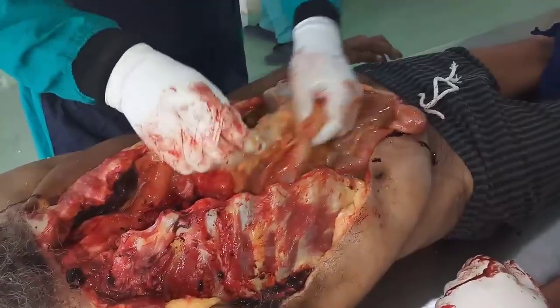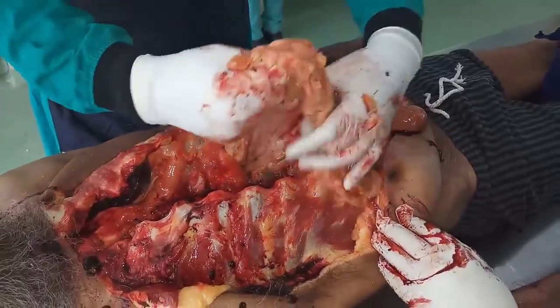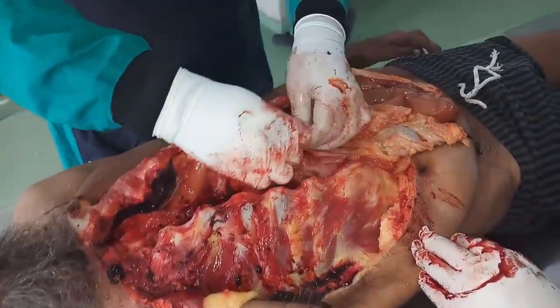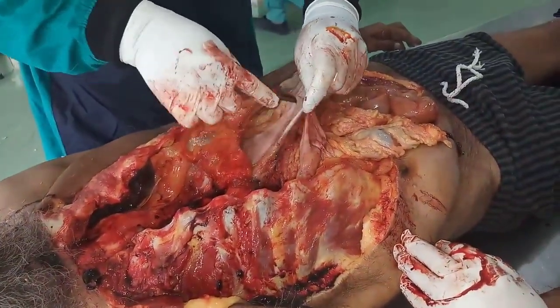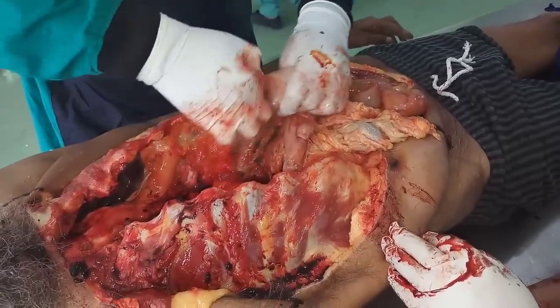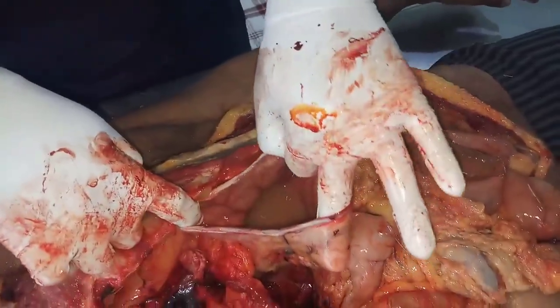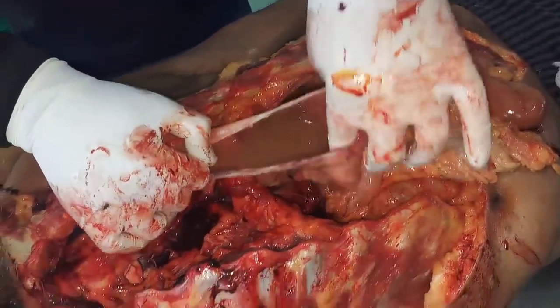This is the intestines you can see. This is the greater omentum. Okay. Greater omentum is attached to the greater curvature of the stomach. So this is the stomach. Stomach seems empty, but we'll just open the stomach. We'll see the interior of the stomach. It's not empty. It has some contents. Liquefied contents are there. You can see the stomach, internal mucosa.